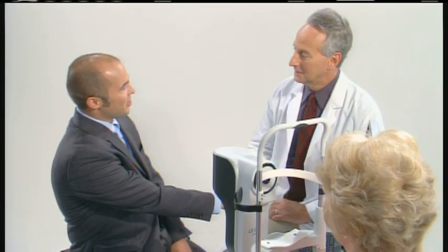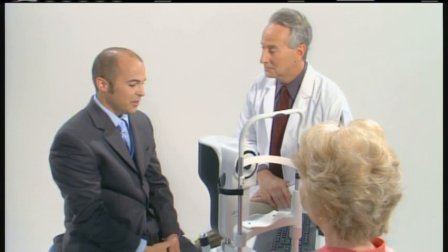Good morning, Dr. Kramer. I'm Aaron with Hogstrike, and I want to give you a demonstration on the new Lensstar LS900 optical biometer.